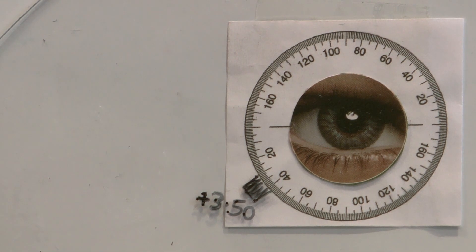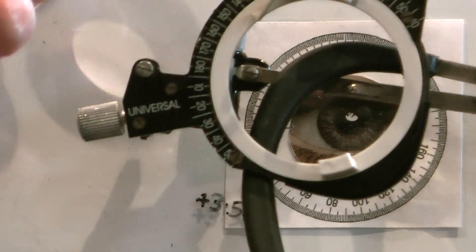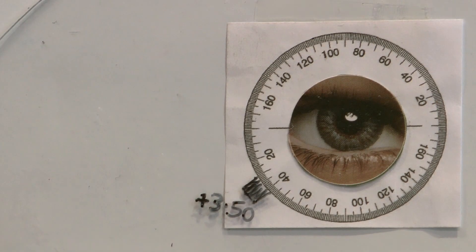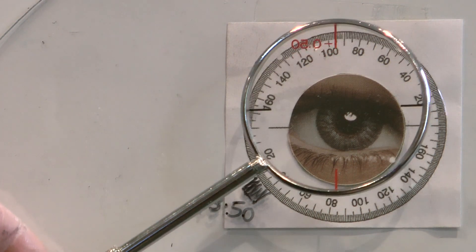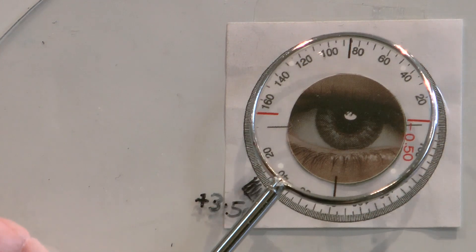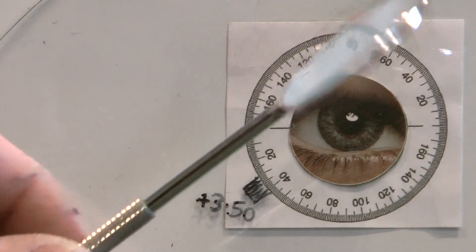In our patient example, we've done subjective refraction and found that their best vision sphere is plus 3.50. We put that plus 3.50 into the back of the trial frame and start the cross cylinder process. We get the patient to look at the concentric circles on the chart. First we need to find out whether they have astigmatism and if so in which direction. We start with the 0.50 cross cylinder, place it in front of their eye, and ask: do those circles look more round, sharper and clearer in position one or position two? Then we repeat — do they look clearer in position one or position two?